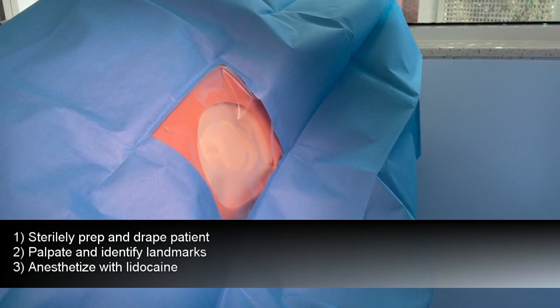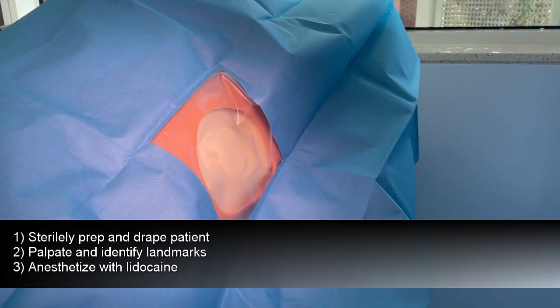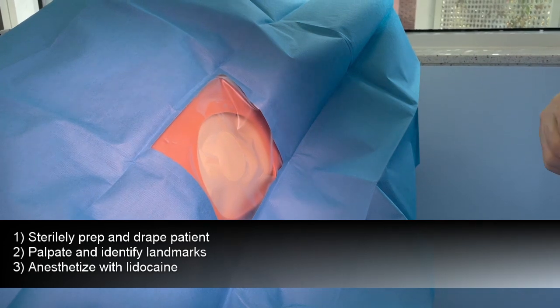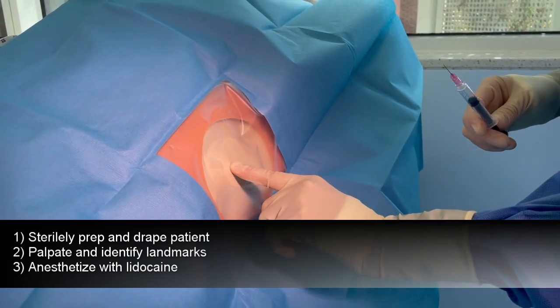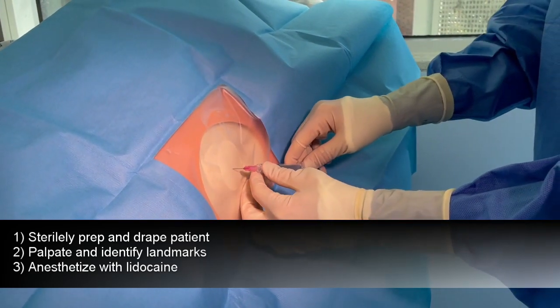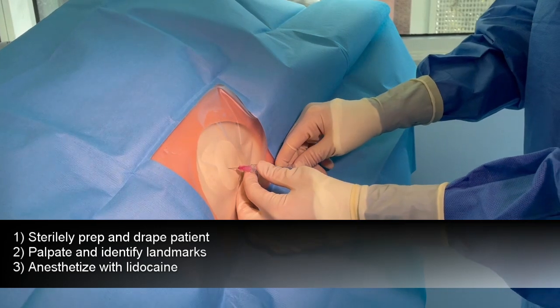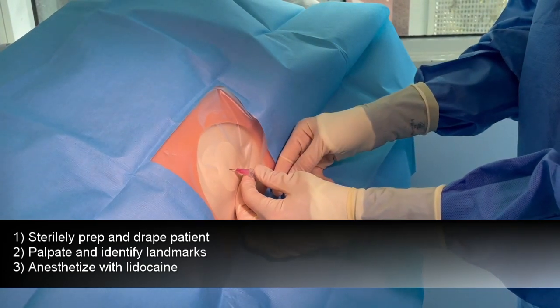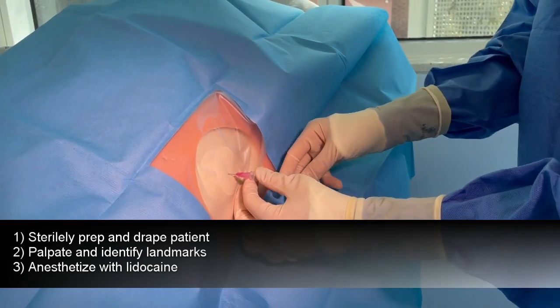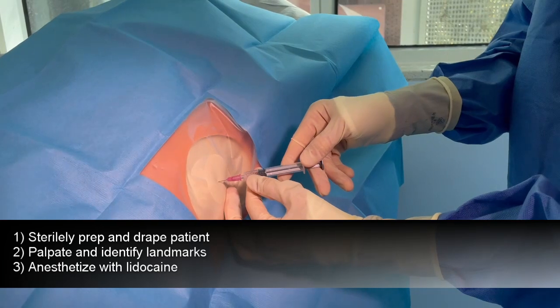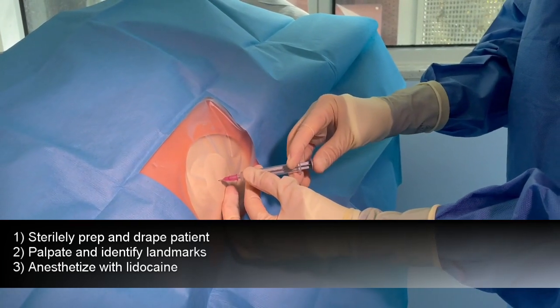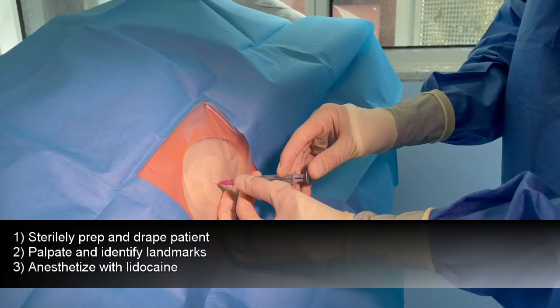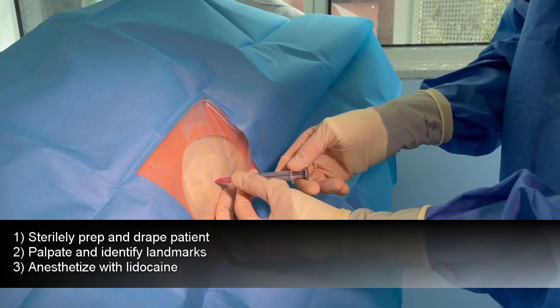First, sterilely prep the patient and drape. Then anesthetize in the appropriate anatomic location over through the skin, then down to the rib, and then over your tract just over the rib.